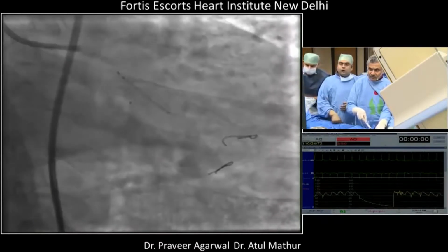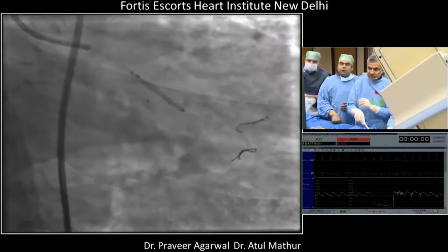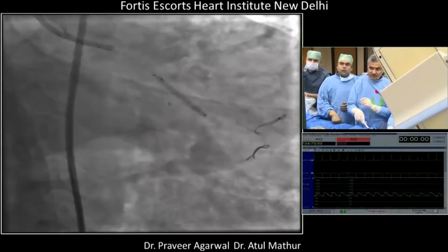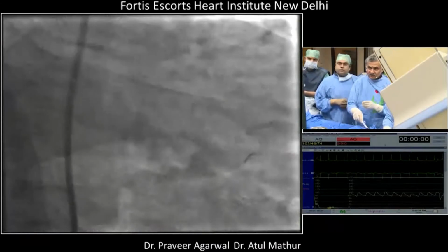2, 4, 6, 8, 10. Negative. The lesion is difficult to yield.